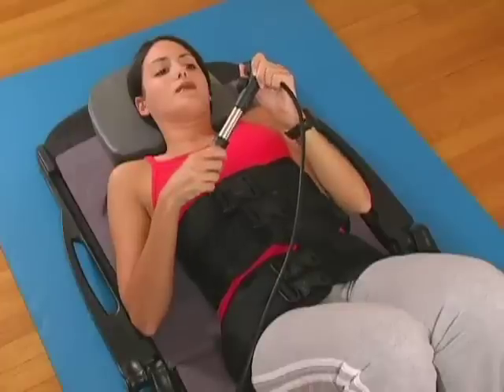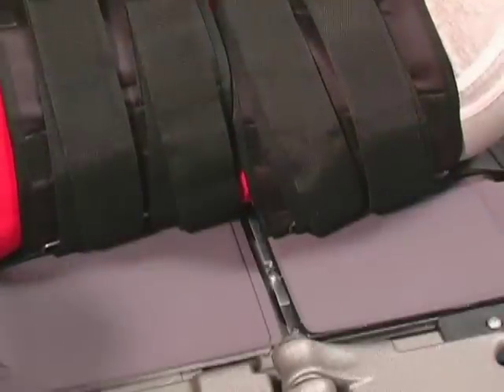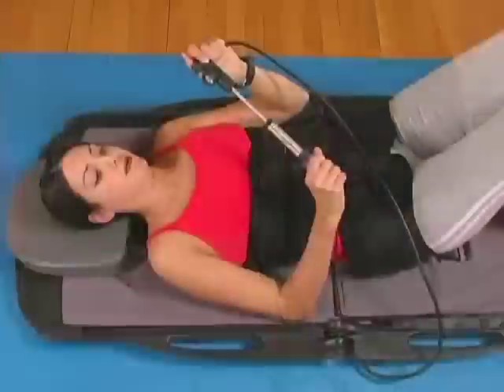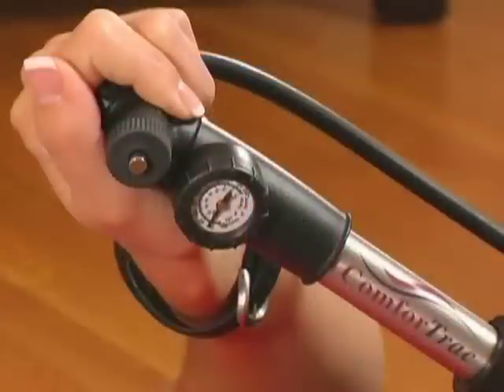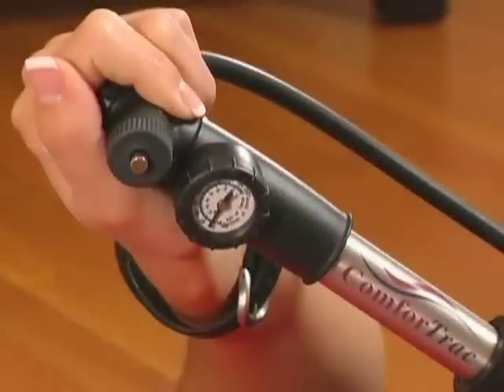Monitor the hand pump gauge and stop pumping when the recommended amount of traction force has been attained. The hand pump will hold the pressure automatically. ComfortTrack features a high quality gauge designed to be extremely accurate.